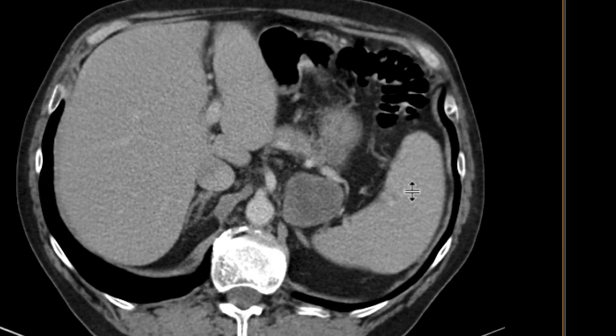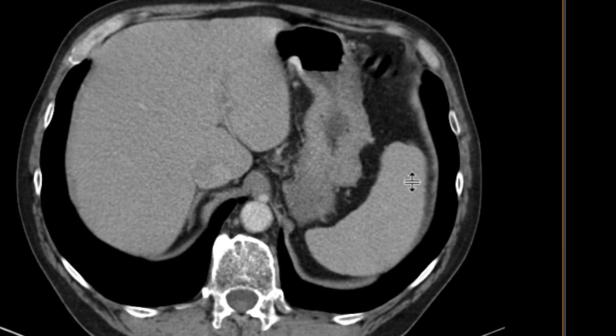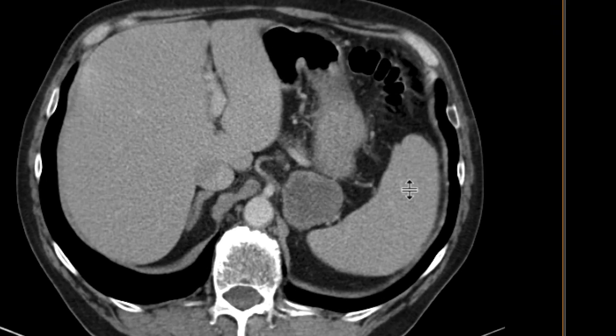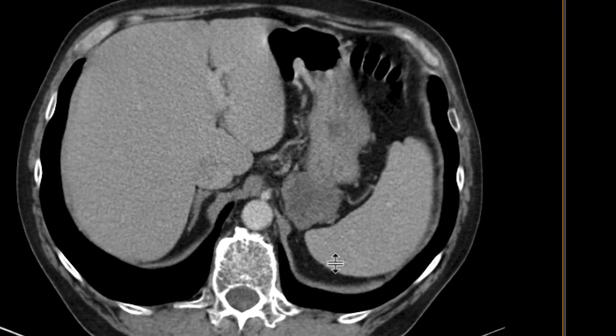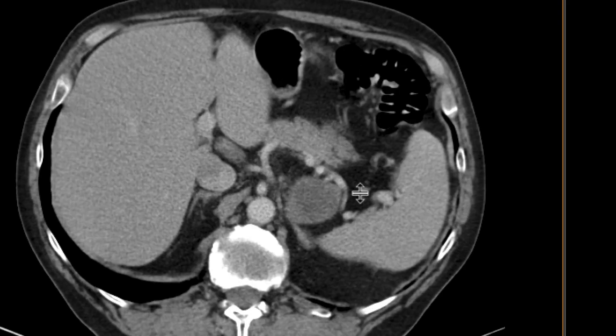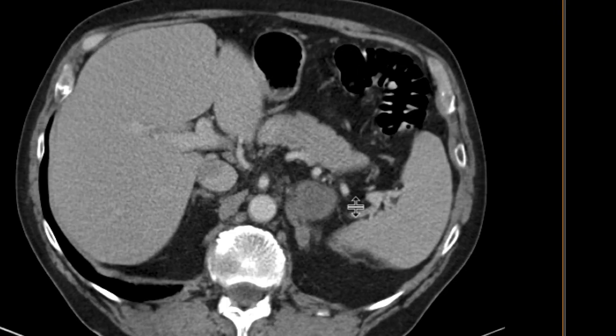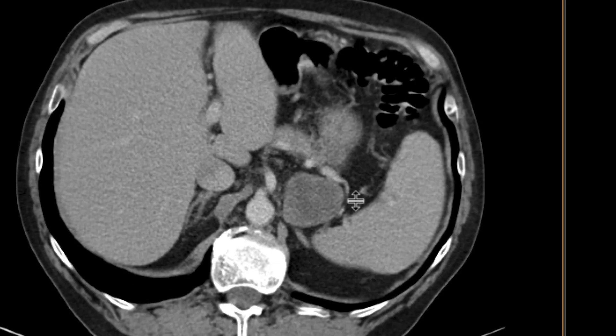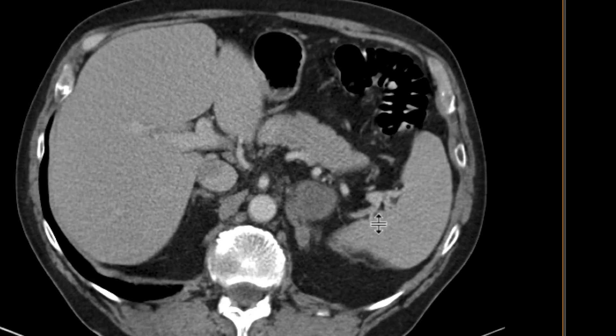You can see this heterogeneous mass. It's sort of interposed between a bunch of organs here — the spleen, the stomach. It's sort of posterior to the pancreas, and you have a portion of splenic vasculature wrapping around it.